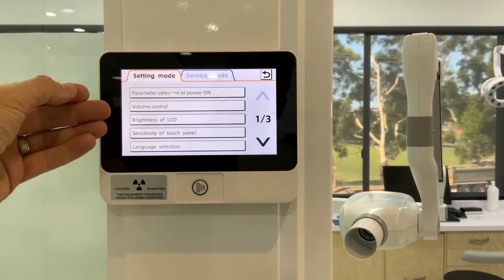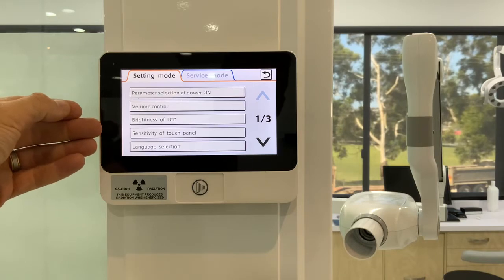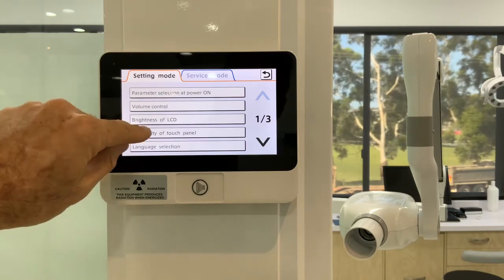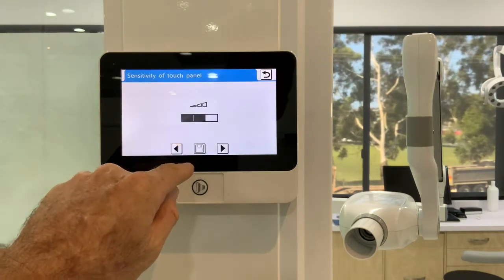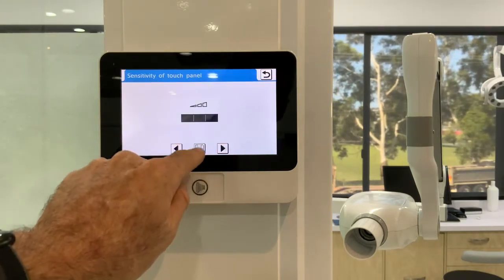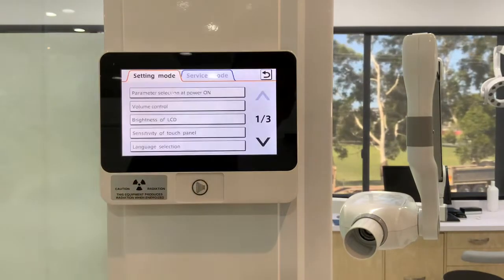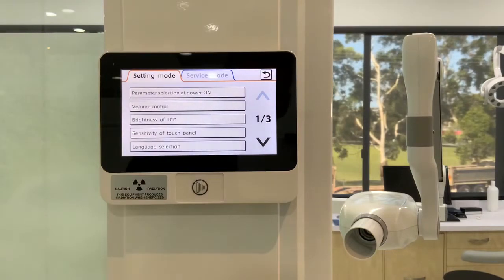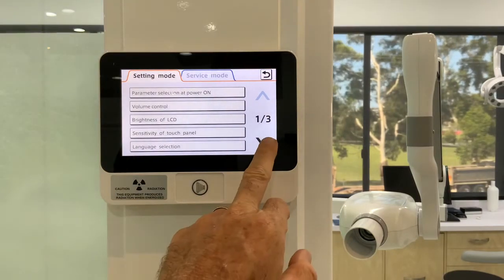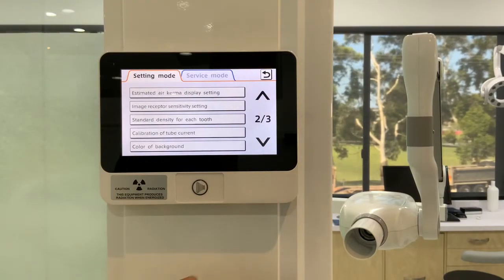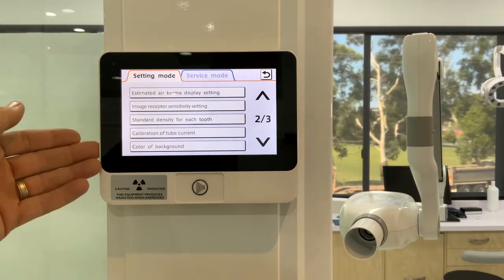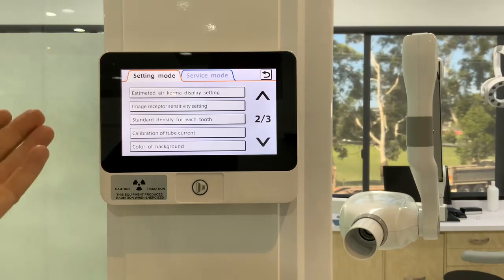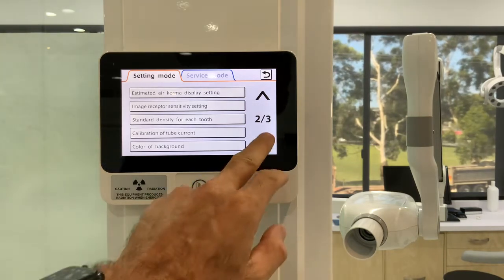Volume control, LCD brightness, sensitivity of the touchpad — so you can take it so it's not quite as sensitive. Just hit the save button when you want to set any of these. Language settings are probably not so necessary to change.